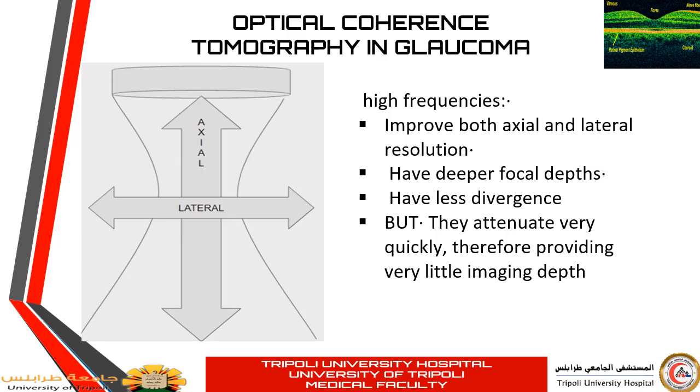And the lateral resolution is not much dependent on the wavelength, but it is dependent on the width of the beam. The smaller the numerical value of the width of the beam, the better the resolution. But in general, increasing the frequency will improve the axial as well as the lateral resolution. But still, we will face a problem with the depth penetration.